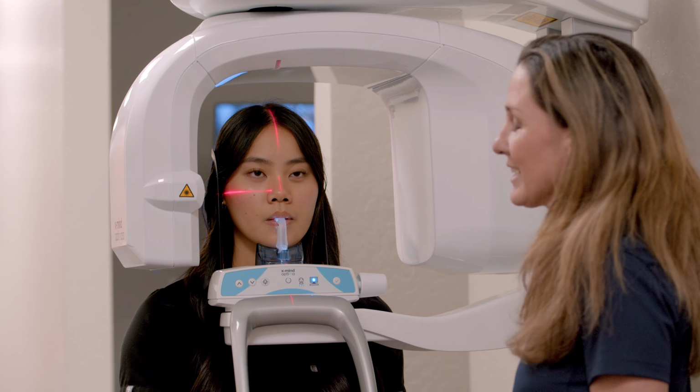Okay, so let's just double check that Vicki is in. We're gonna go ahead and make sure everything looks good. I'm gonna get you just that slight tilt of the chin again. Go ahead and keep your chin down. Do you feel like you're standing nice and tall? Shoulders are dropped. Okay, perfect.